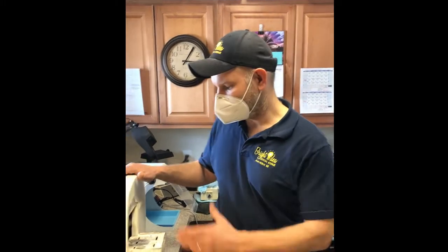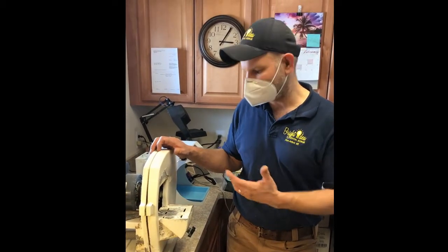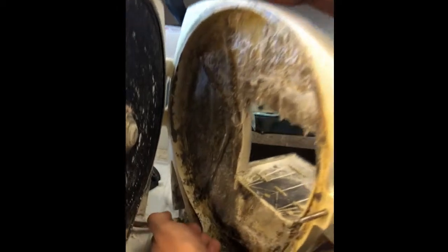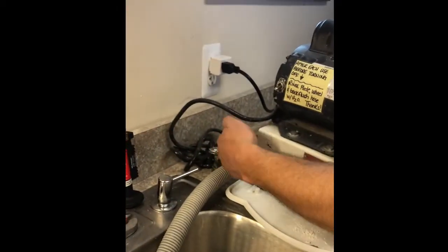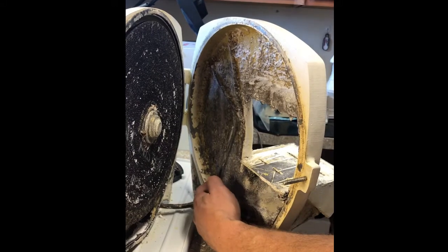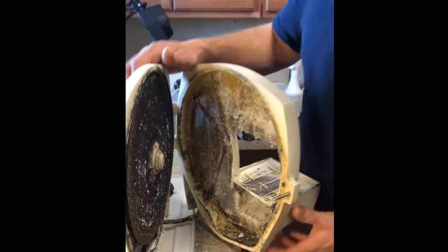Today we have a model trimmer that is not spraying water, and this is a fairly common issue that we find. Inside the model trimmer, there's a copper tube where the water goes. It goes from the water right here through a tube through here. So when you turn the water on, the water should spray up and hit the disc. What happens is this will clog, and it will end up not being able to spray water onto the disc.